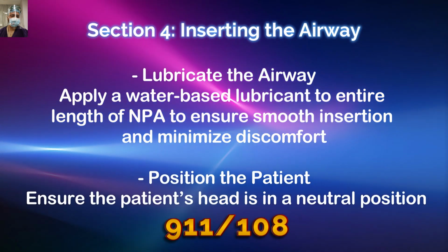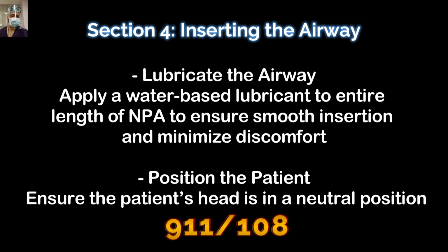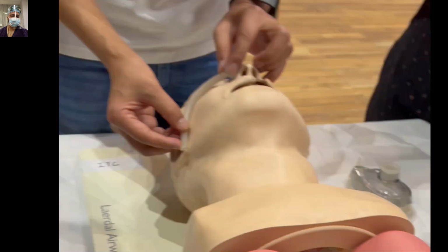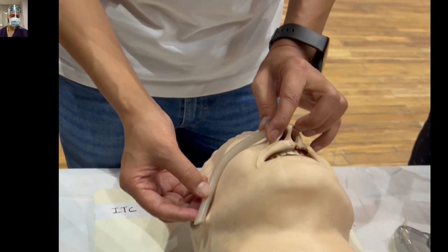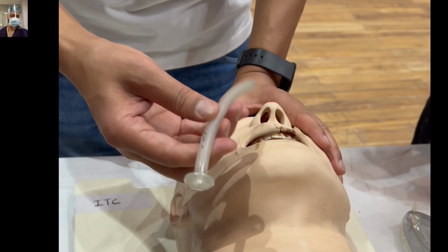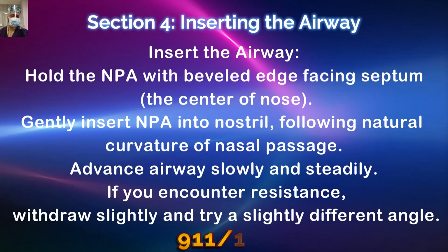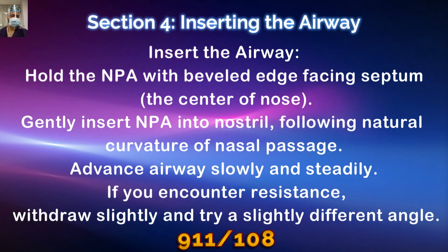For inserting the nasopharyngeal airway, lubricate the airway with commonly available water-based jellies like Xylocaine jelly. Position the patient's head in a neutral position. Normally we always tilt the forehead back and lift the chin, but in this situation, we keep the patient's head in a neutral position.